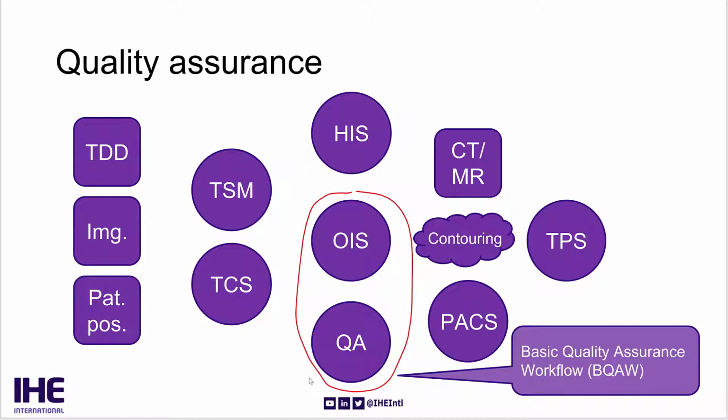And this is a key aspect, that the quality assurance devices should be able to send an assessment of whichever calculation or measurement they did and a comparison to the treatment plan, to also send that along with the information of whether or not that should be considered a pass or a fail, or if it should be reinvestigated.